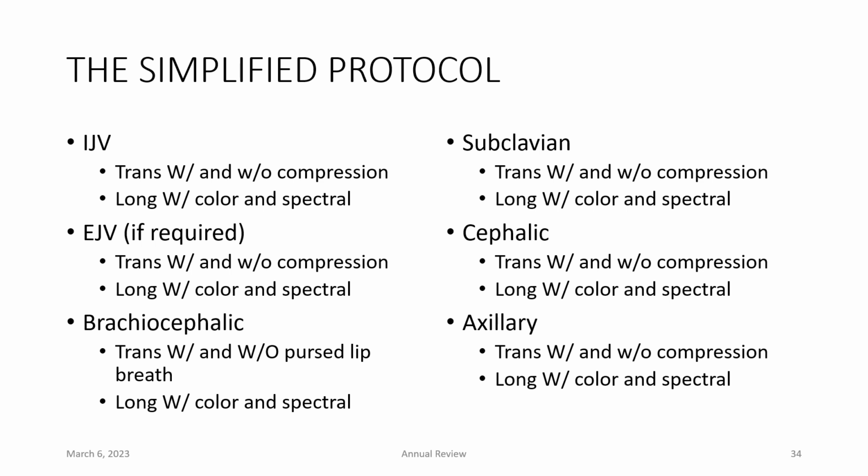All right, so now as we're going out down our arm, we know that the subclavian was the vein that joined with those jugulars to create the brachiocephalic. So from the lateral side of that confluence of the subclavian and the jugulars, where that brachiocephalic was formed, that's where we're going to identify that subclavian. Part of it's going to be above the clavicle, and then it will dive deep to the clavicle as you get more towards the arm.